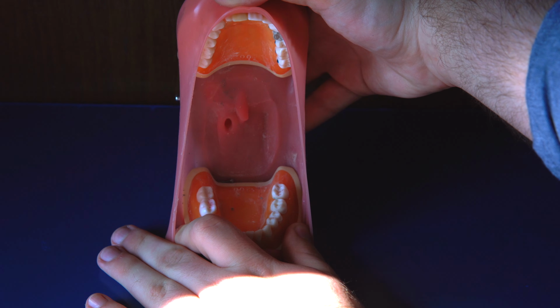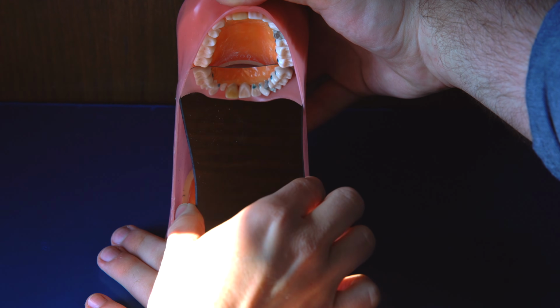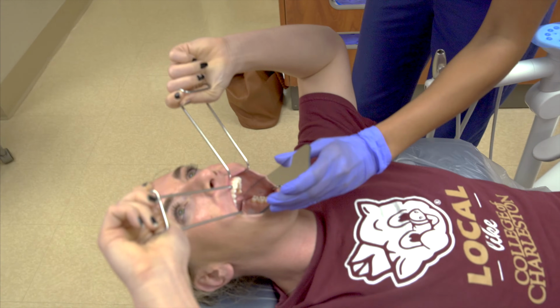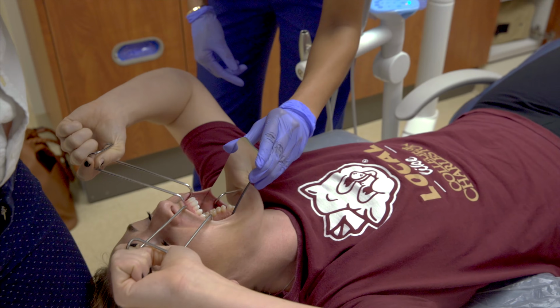We will do the exact opposite for the maxillary arch. Place the mirror on the maxillary tuberosities, then tilt it as much as possible. Have the patient hold the retractors, pulling her upper lip towards her head, tilt the chin upward, and take the photograph. You want to capture the whole arch.